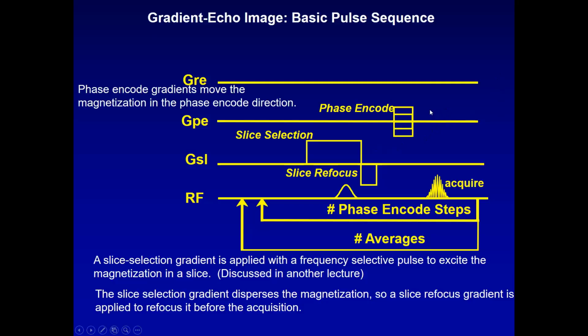Well, the next thing that happens is the phase encode gradient clocks out. Now this might be, in the picture I was showing you before, this would have been in the Y direction. We do all this, and then we apply the lowest extreme on the phase encode. And then we open the receiver. We do it again, and we acquire a little not so far negative on the phase encode, and we open the receiver, and so on, over and over, and with a different step, a different amplitude on the phase encode every time.